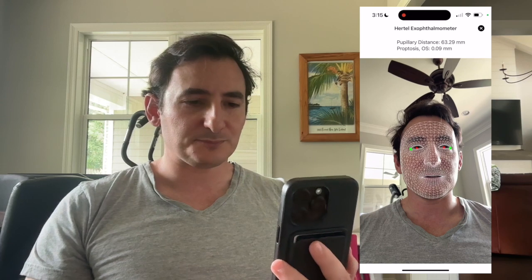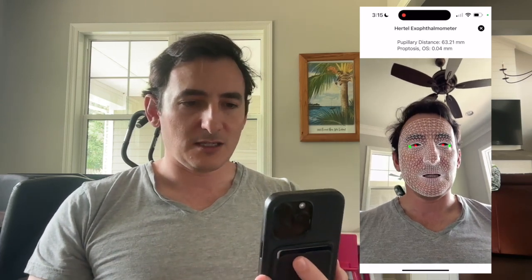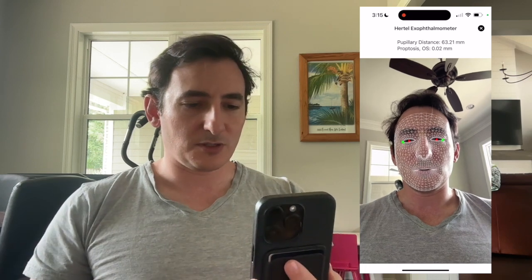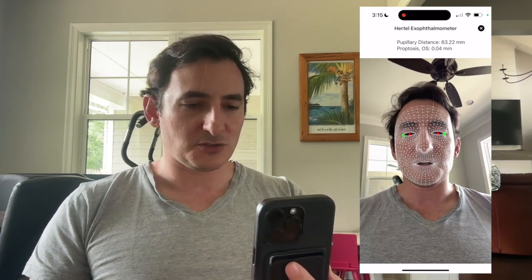You can see that if I try to fool it and simulate a proptosis, you can almost trick it, but it recognizes that you're just changing your head and that it's not true proptosis. Now, augmented reality apps are prone to errors and this isn't an exact science, but if you want to check someone for proptosis, or if you're just trying to watch to see if anything changed over time, this provides an alternative to your traditional Hertel.